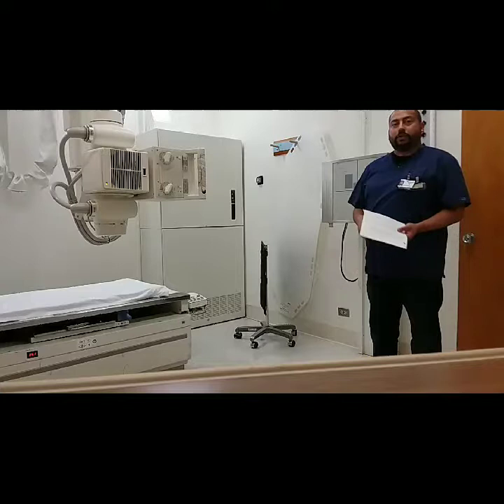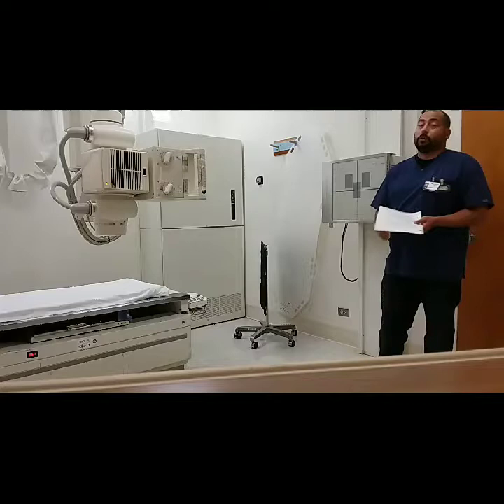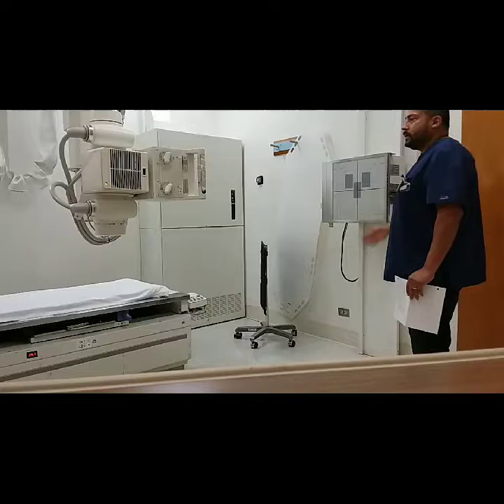Today we are going to shoot a two-view chest x-ray. A two-view chest x-ray consists of a PA projection and a lateral projection. Before we start, we'll get the room ready before our patient comes in. I had already detented our tube to 72 inches to the Bucky.